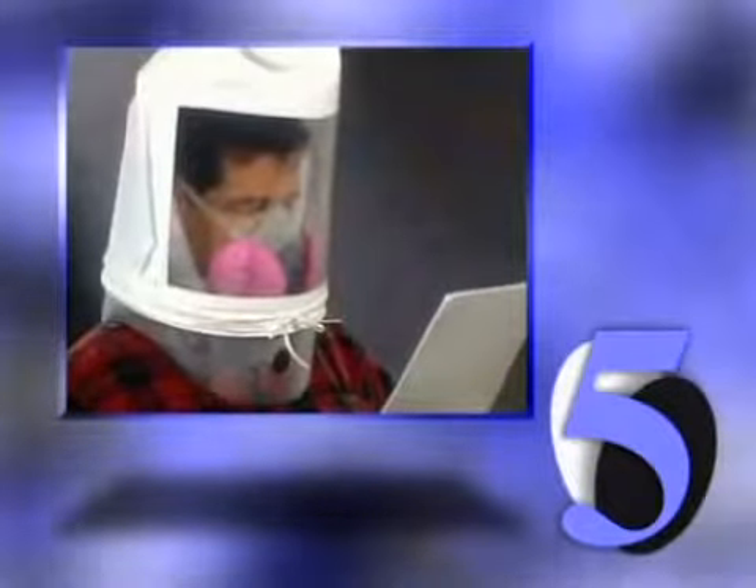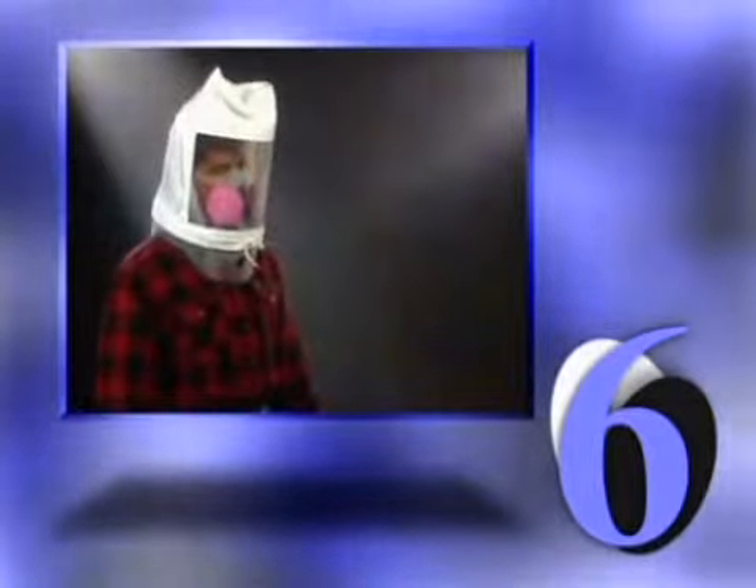4. Nod your head up and down, holding at each position for one or two breaths. 5. Talk — read the rainbow passage slowly out loud. 6. Bend over — bend at the waist as if touching your toes. Be sure to hold on to the hood when bending over. You may substitute jogging in place of this exercise. 7. Breathe normally again.